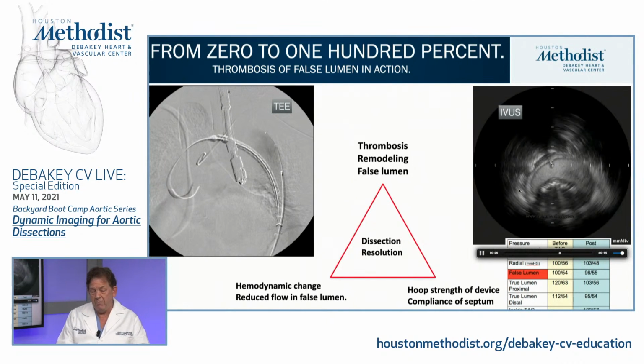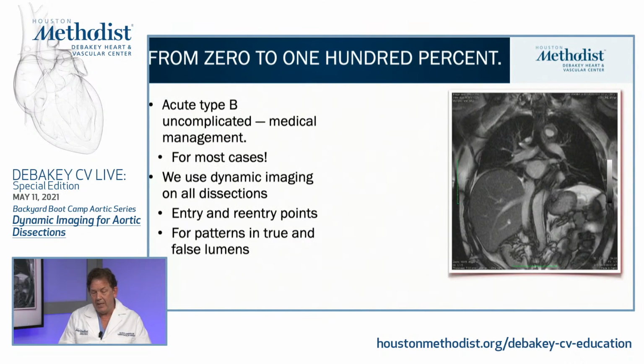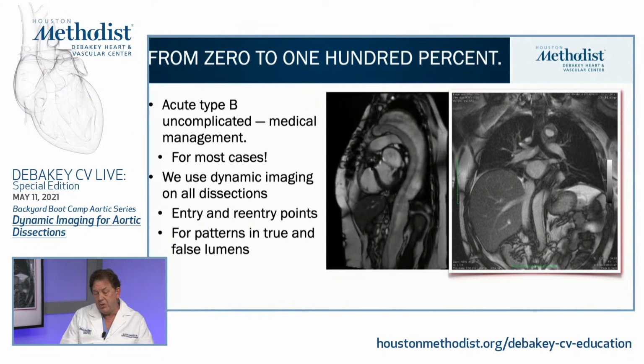This was probably one of the first times I'd ever seen anything like this happen. So from 0 to 100%, sometimes with these patients we opt to do nothing, just medical management. Sometimes we have to cover it. I'm not going to go into all of that. We tend to use dynamic imaging. This is an example of a dynamic MR. We may touch on it as the candy cane view.